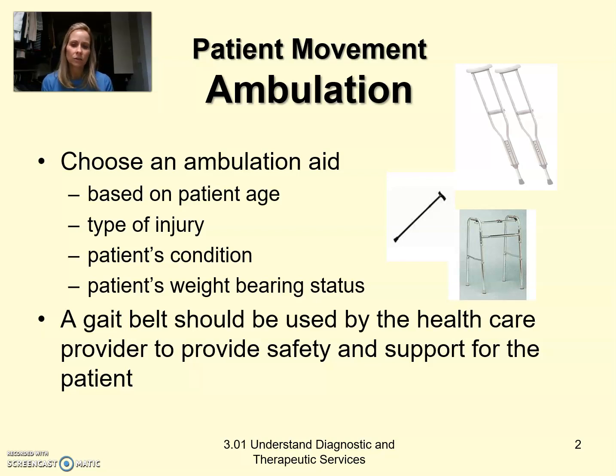A lot of that just has to do with preference and what's acceptable and what is preferred by the patient. If you need more help than a cane or crutches, a lot of times older people would use a walker, where younger people may use 2 crutches.